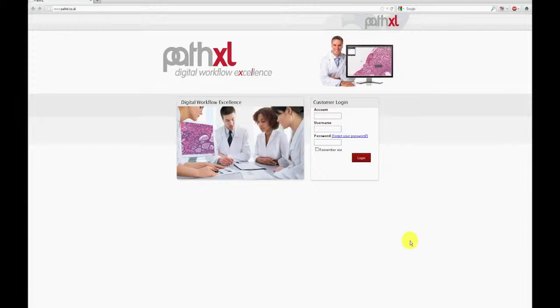PathXL Tutor is PathXL's online digital slide and content course creation system, which can support all of your needs for delivering education and training materials in histology and pathology for access by your students or your residents anytime, any place. It can be accessed via any browser by typing in the defined PathXL or Digipath URL within your country of residence.